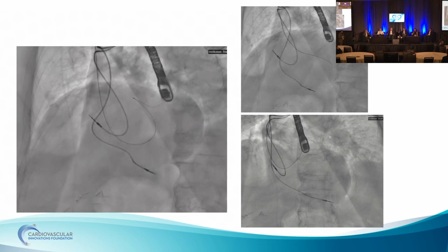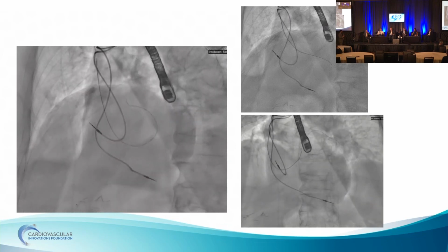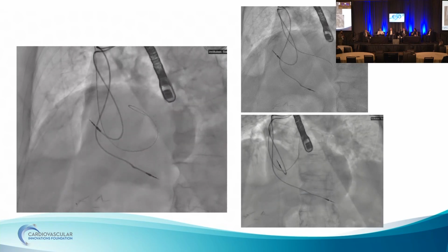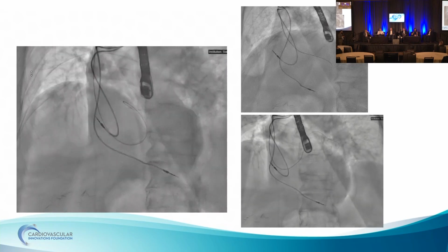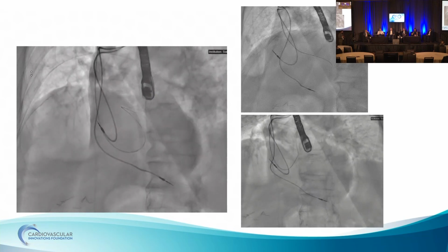I will say that we definitely talked to the patient and said, listen, with PFO closure we're not going to get a huge benefit from this. But I think it was in his head and in his wife's head more so that we need to close this, because the stroke was pretty scary to them.